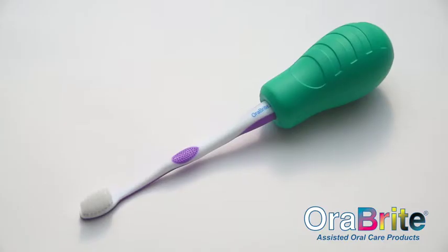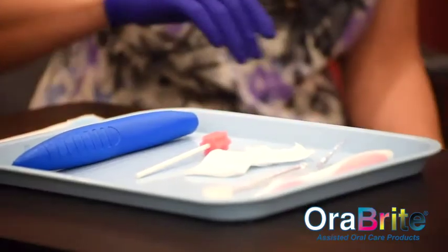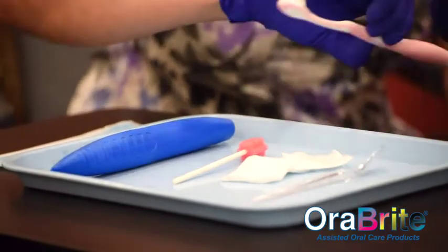Orabrite has designed the Grip Easy Expander and Extender toothbrush aids, which allow patients to regain independence and improve their oral hygiene.